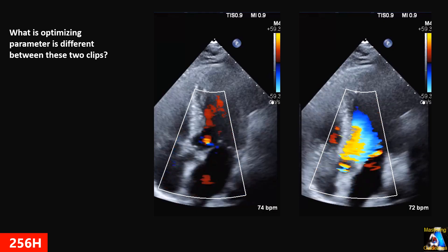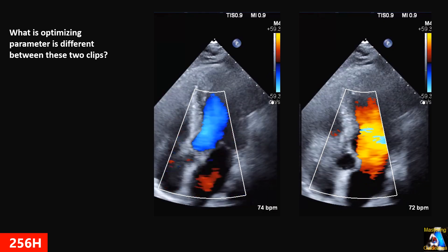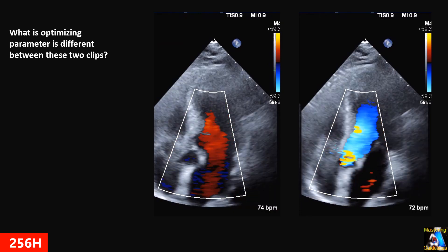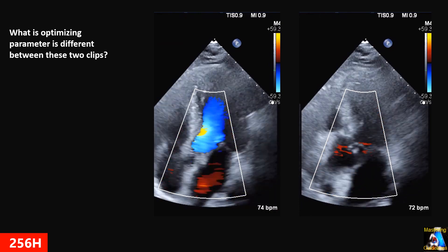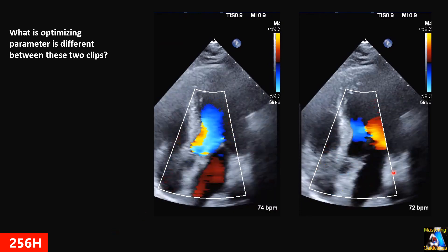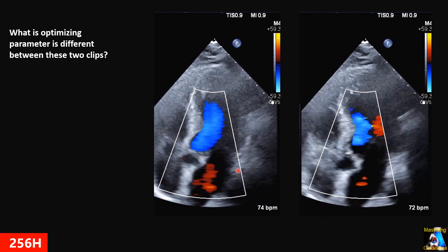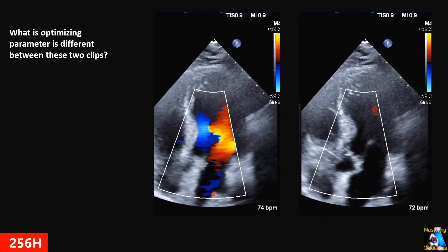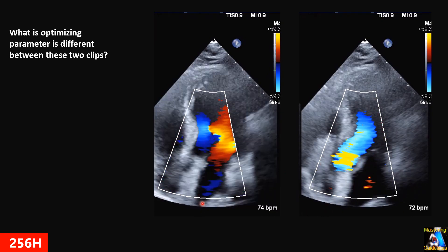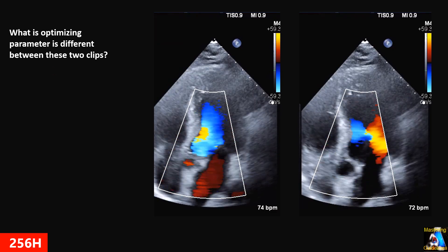Here we have two clips from the same view, same patient. There are a little difference between them. What optimizing parameter is different between these two? Which one is the correct one and how can we fix it?